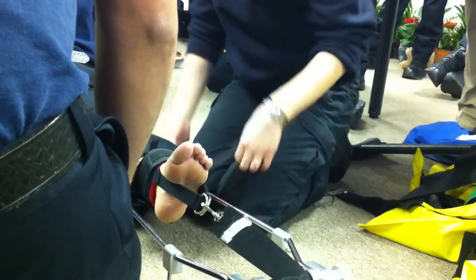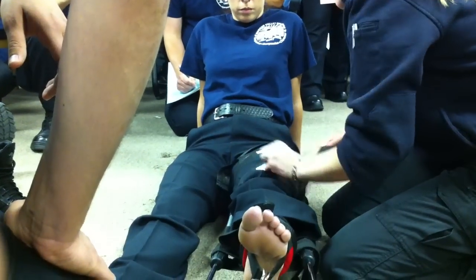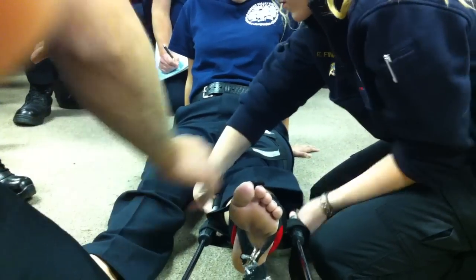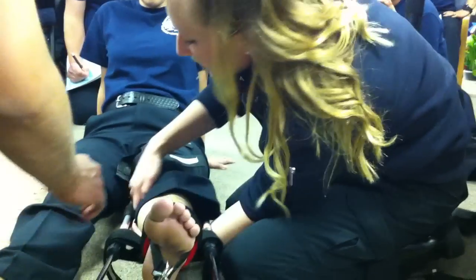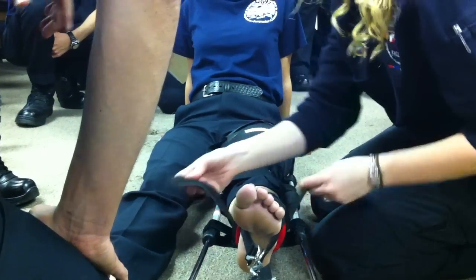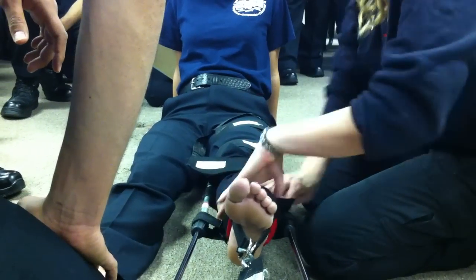Alright, so we've got 1 through 4. Is there a particular order? Work high towards the feet. I start high, work low. This one will go up above the fracture site. Here's mid shaft, so hopefully you can get your strap up high enough that it won't be over the actual broken femur. Then this one goes above the knee, right above the kneecap. This one will go below the knee. And then this last one you can either go over the hitch or right there. Alright, so it's secured.